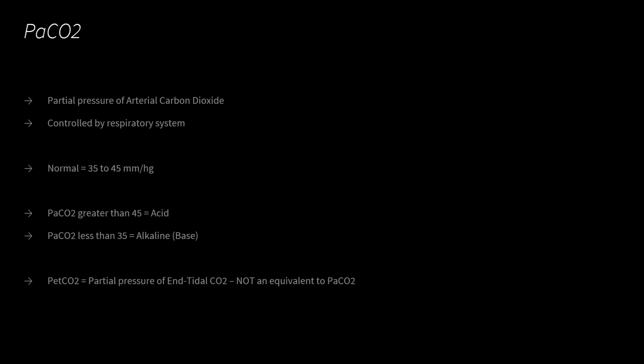And then anybody in emergency medicine knows if you are monitoring CO2 in a cardiac arrest and all of a sudden it jumps up really high, that can be a predictor that you got return of spontaneous circulation, because now the lung parenchyma are being saturated by blood, and that CO2 is now able to diffuse across and be sampled.